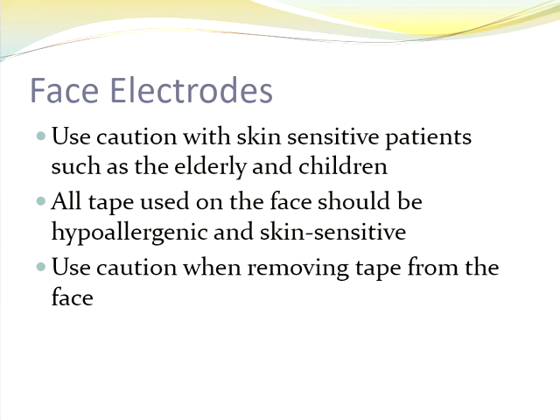Use caution if your patient really has sensitive skin, like if they're older, younger, and just the face in general can be quite sensitive, so don't over abrade them. All the tape that we use is hypoallergenic and skin sensitive, so make sure you're using the appropriate tape. There are medical grade tapes out there that are not meant to be on the skin though, so you have to pay attention to that. And the biggest thing too is make sure you're being really careful when you're taking the tape off, because that can really cause a lot of irritation for our patients.